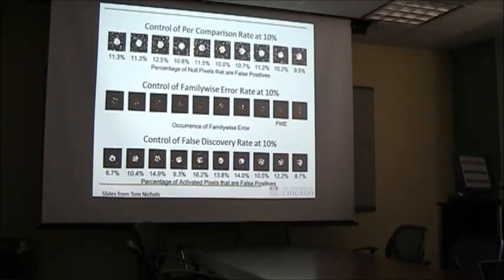You're also more often declaring stuff that's outside of your actual signal statistically significant. Right. And the important thing to recognize is these values are identical. So basically, what it means is that controlling for the family-wise error rate or using a false discovery rate at the same level leads to a different outcome. And it's usually the case that the false discovery rate is a more lenient way of correcting for these multiple comparisons than the family-wise error.